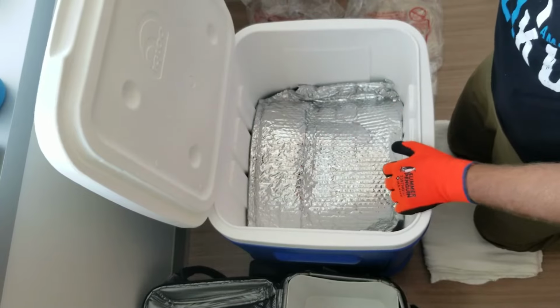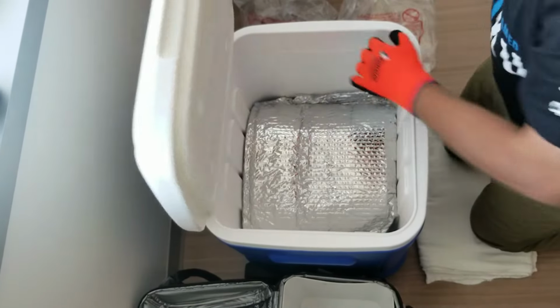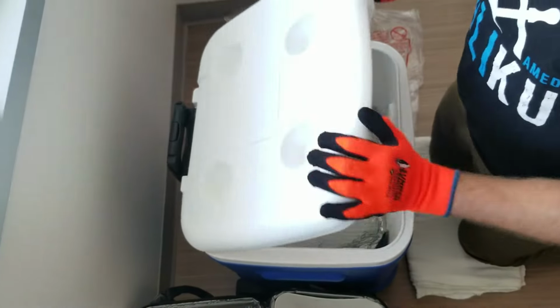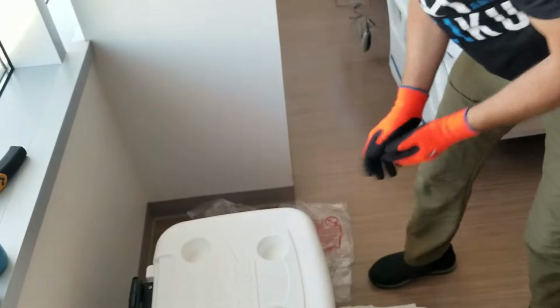I got about 50 to 60 pounds of dry ice. It seems that 50 to 60 pounds is the magic number, and if you have to go longer for some reason, 60 pounds is safer, and you definitely don't want to run out of ice during this process. So that's pretty much it.